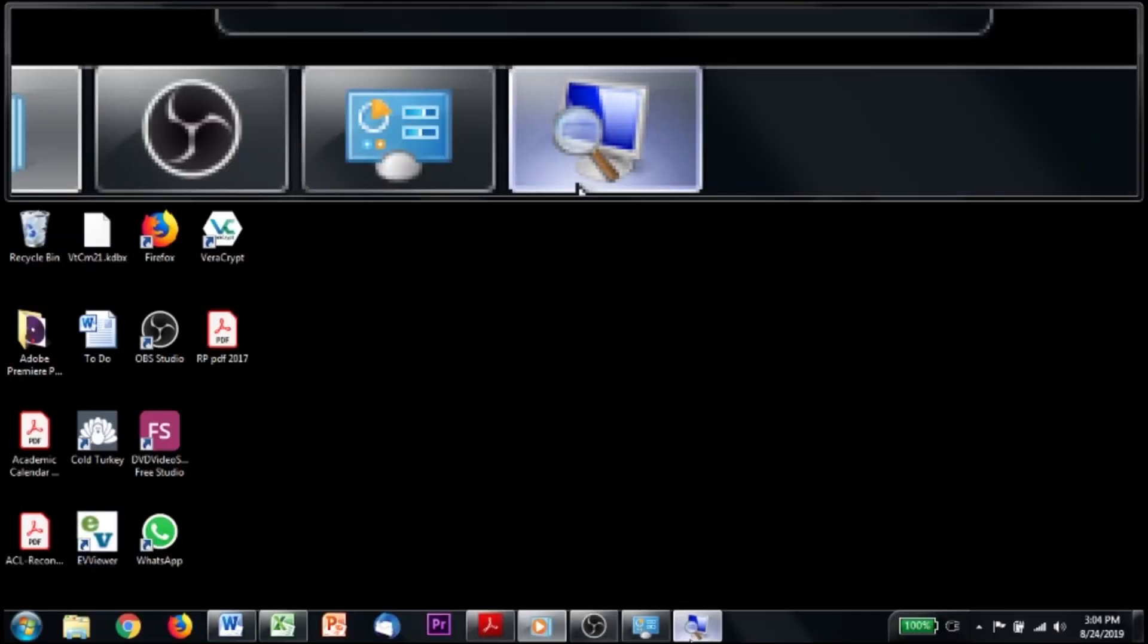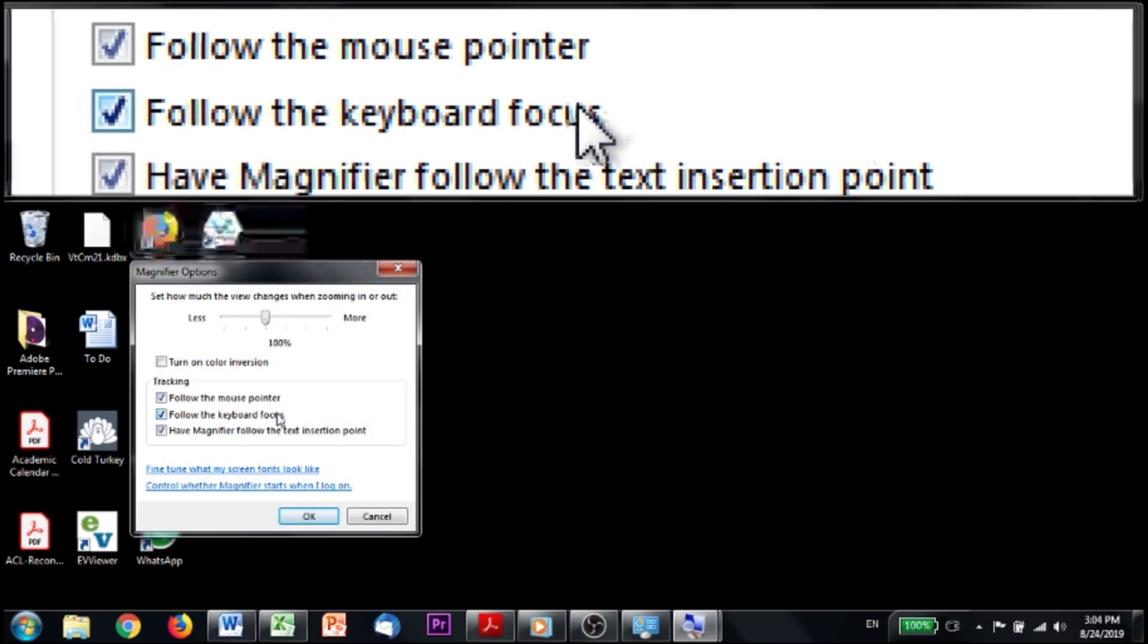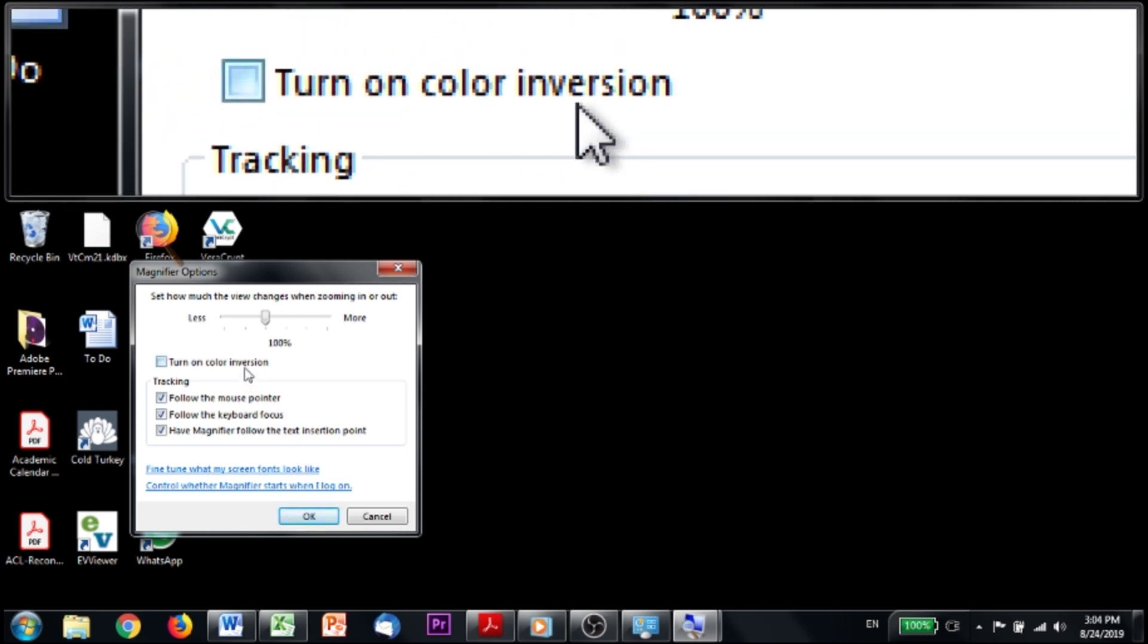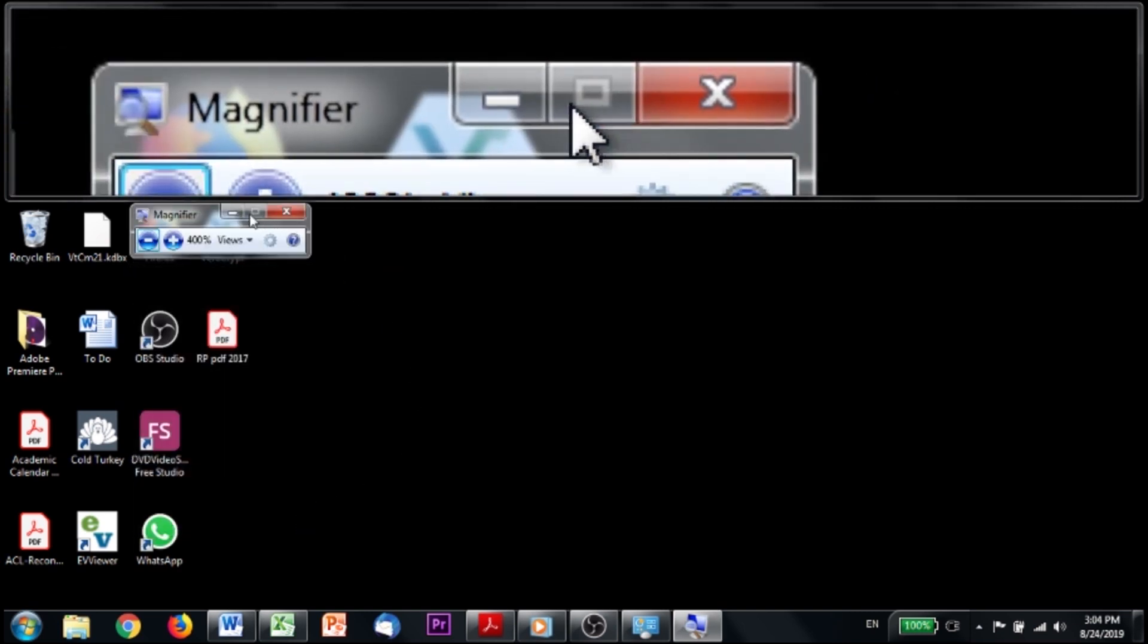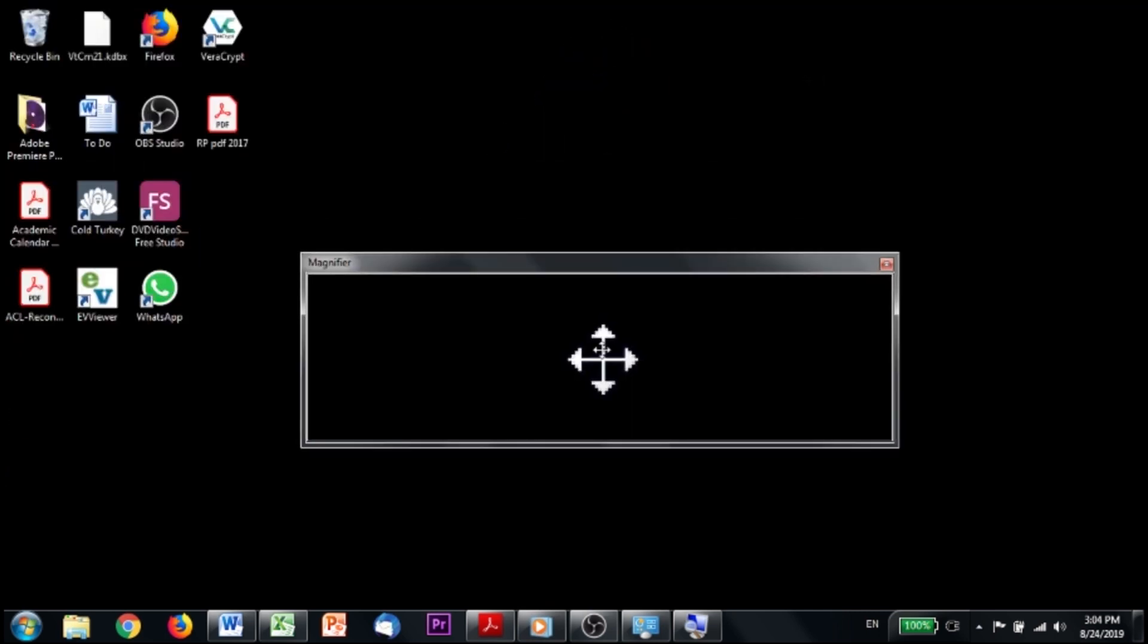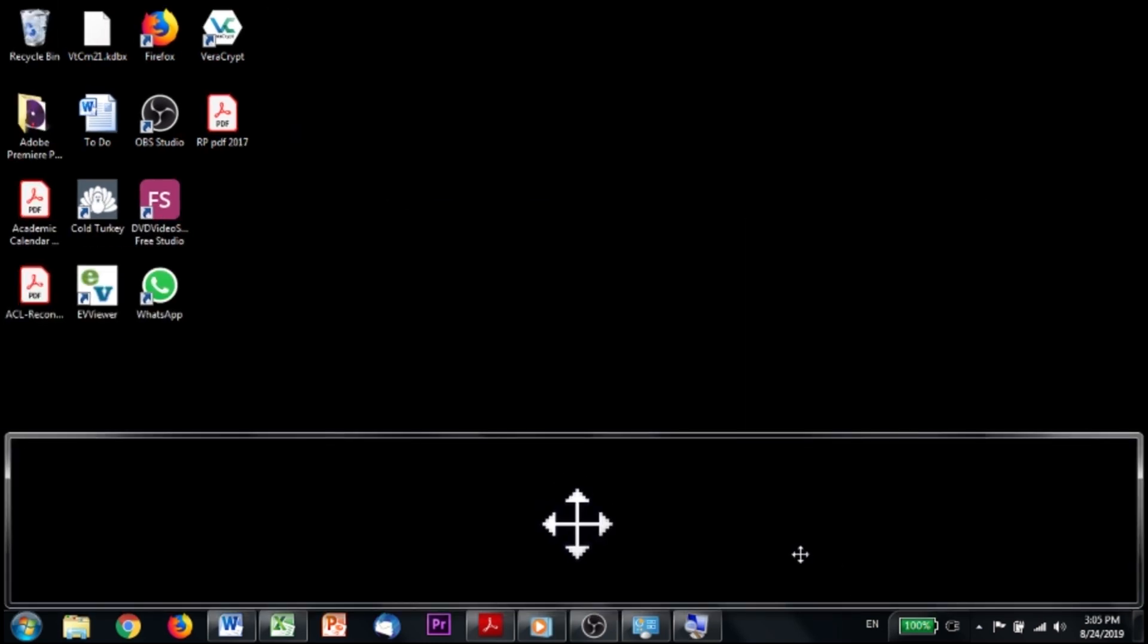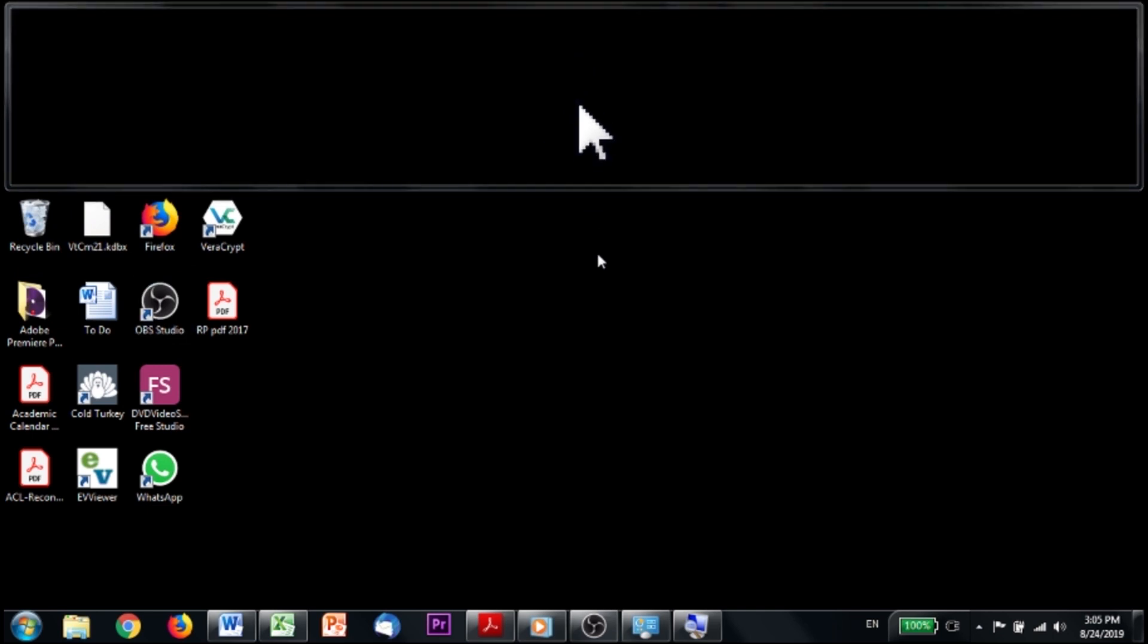And up here, you can change some of the settings as well. I always have it follow the keyboard focus because that means that when I'm typing, the bar follows my typing without me having to move the mouse, which is extremely important. Otherwise, I would never be able to see what I'm writing. And you can also invert the colors, which I will show you in a second. Down here is where you can choose whether the magnifier starts when you log on to Windows. I really like this docked view because it's really versatile. You can change the size of it like this. You can drag the whole thing out and move it to one side of the screen or the other. Right, left, bottom. Most of the time, I leave it up top and just change the size of it depending on what I'm doing.